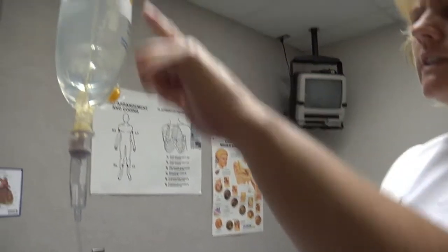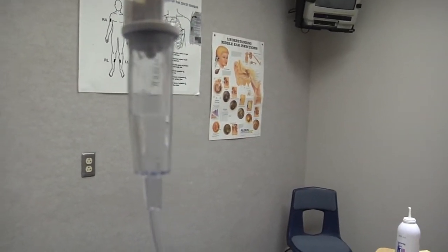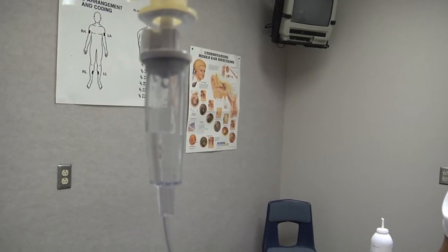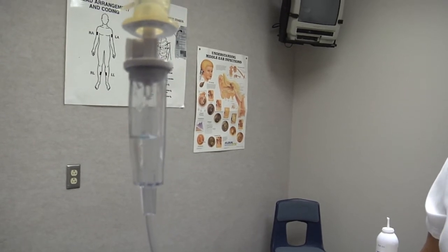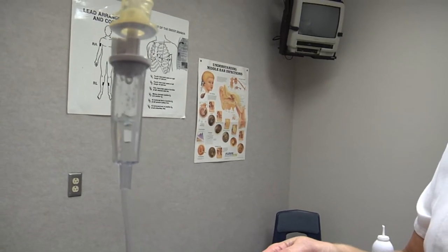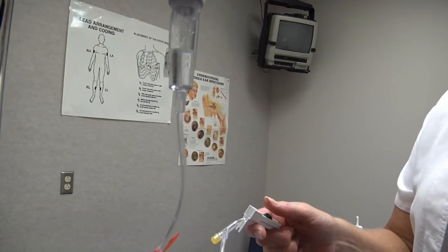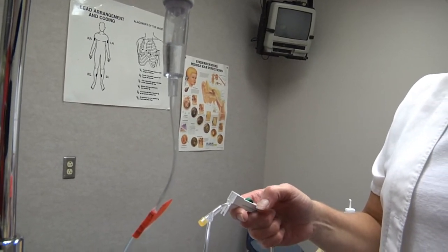Next, we're going to follow it down and look into that drip chamber. The drip chamber should be half full, and that's where the solution is right now. And then we would count the drips and make sure that it is running at the prescribed rate. Now, if I came in and it was running this fast, I would know that that IV solution is running too quickly. So then I would go to my roller clamp and roller it down to close the solution down so that now it's dripping at the prescribed rate. And I could determine that by timing the number of drips that falls within a minute period of time.